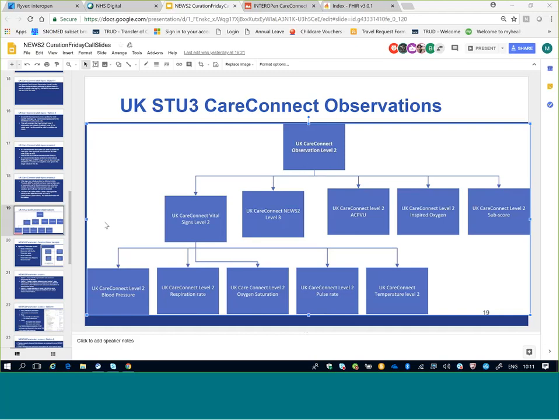Right. Okay. So are you saying, apart from sending subscores, you are actually sending the color scheme as well? Yeah. Although our integration lead is on the call too, I believe we've implemented that through supporting sending a particular image file through. But it is incredibly important from a clinical perspective that at a quick glance they immediately see the severity of the score. So it was a must for us and our customers, when consuming this data through a third party system or a portal view, that those colours were supported. Okay, thanks. That's helpful. We can consider that as a requirement internally, if we could meet it in the first phase.